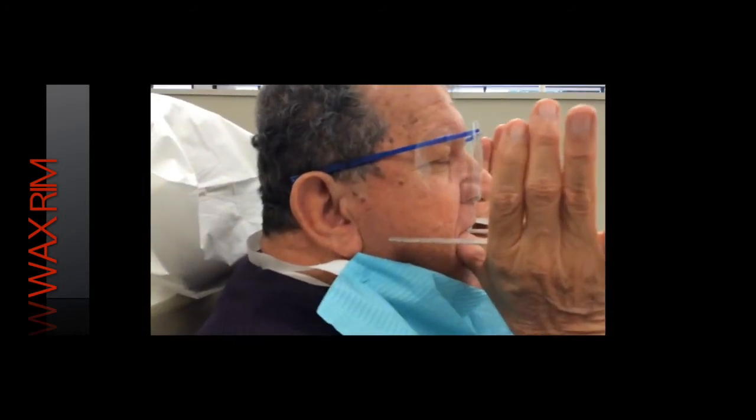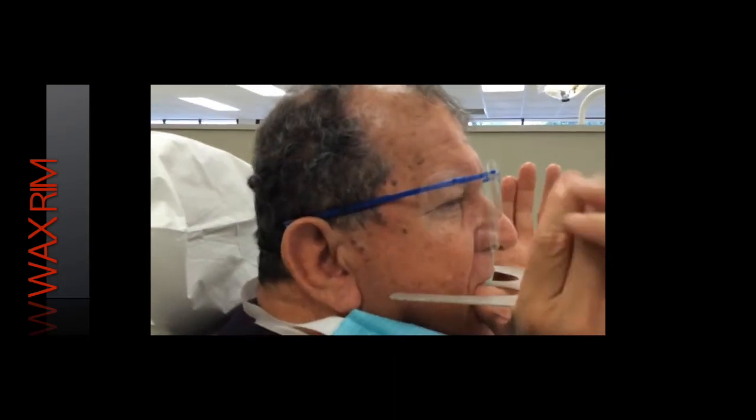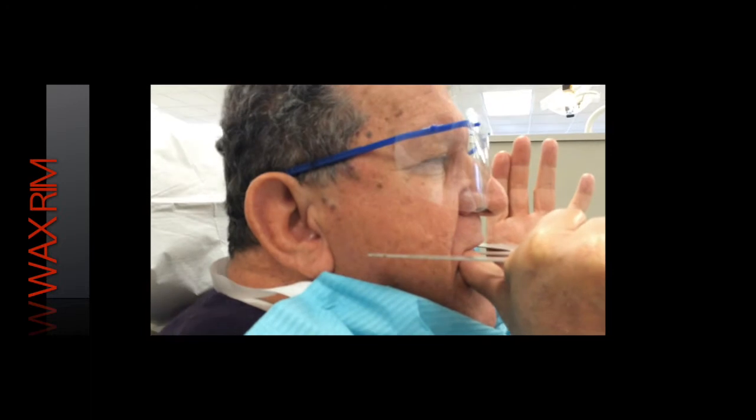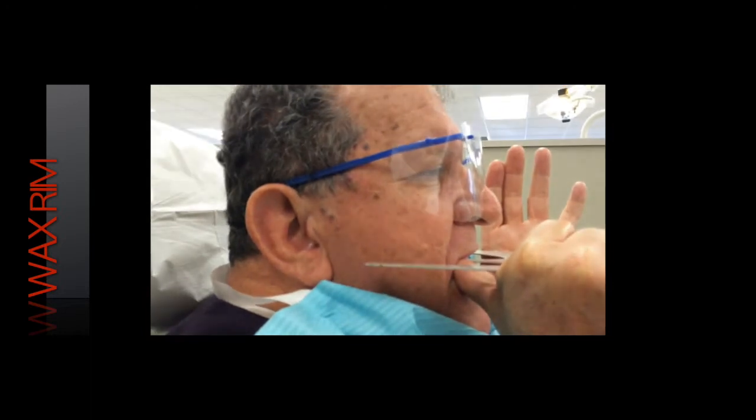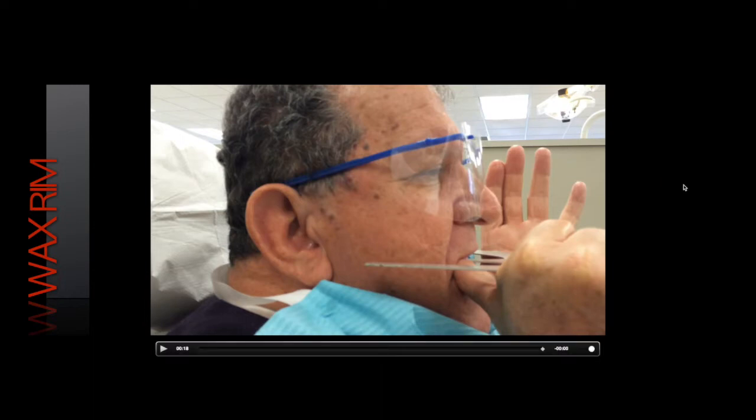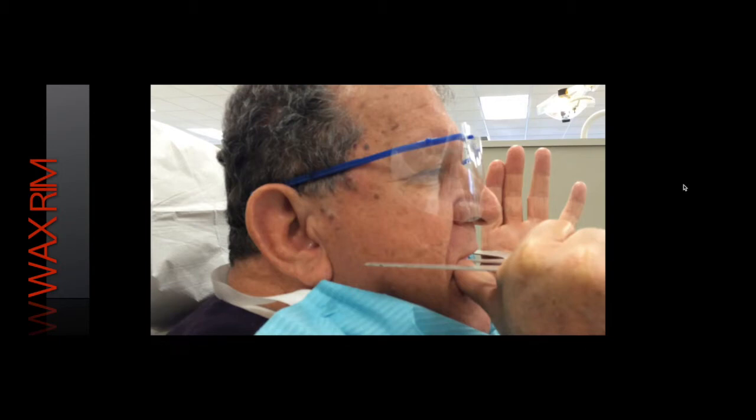In the conventional way, when using the wax rim, you can establish the frontal view and sagittal view by holding the Fox plane. You can see the current wax rim and occlusal plane are slightly tilted — the patient's left side is lower. On the side view, which is the sagittal plane, you can check whether this occlusal plane is parallel to Camper's line, which is the ala-tragus line. This is the evaluation before adjustment.